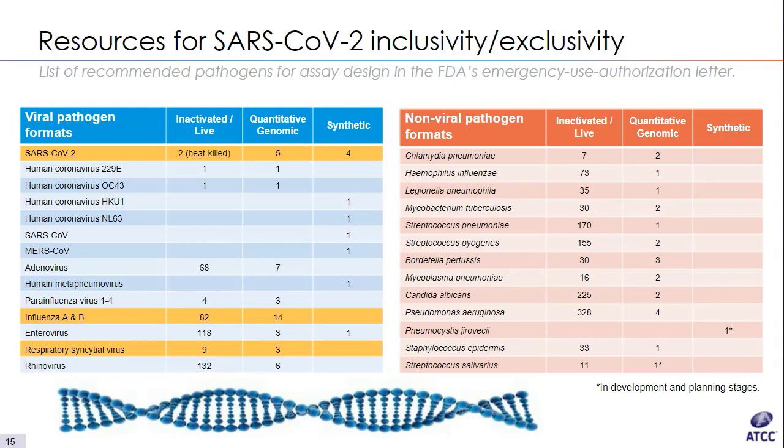If you look at this list, the coronaviruses, the adenoviruses, rhinoviruses, TB, Chlamydophila pneumoniae, Streptococcus pneumoniae, Bordetella, it's very heavily focused on respiratory pathogens. And if you're going to undertake all of the work to make an assay, it's nice to know that it won't be derailed by a stray E. coli or Cutibacterium acnes in a patient sample.